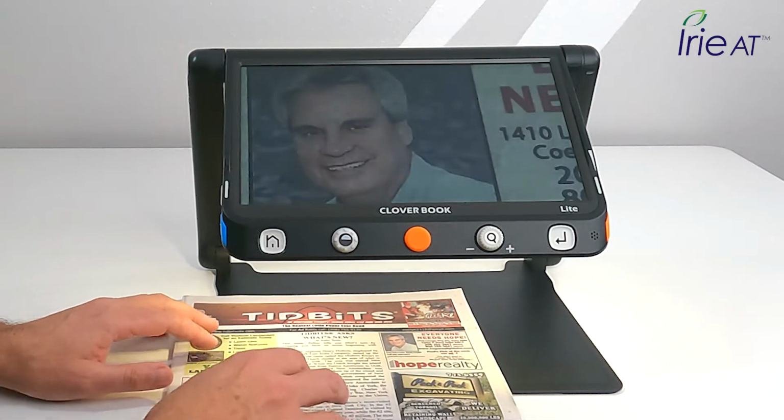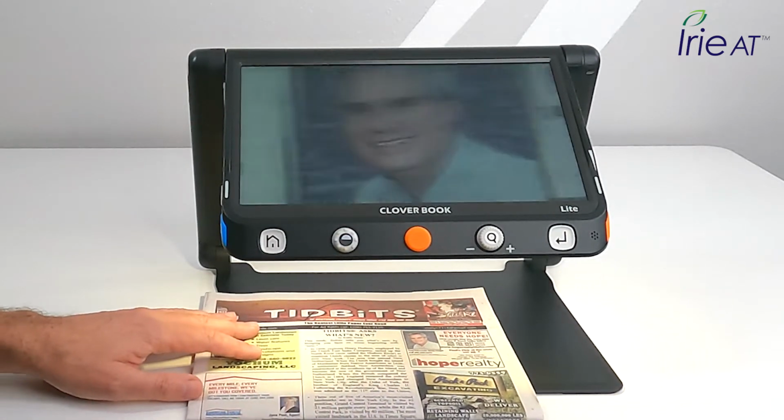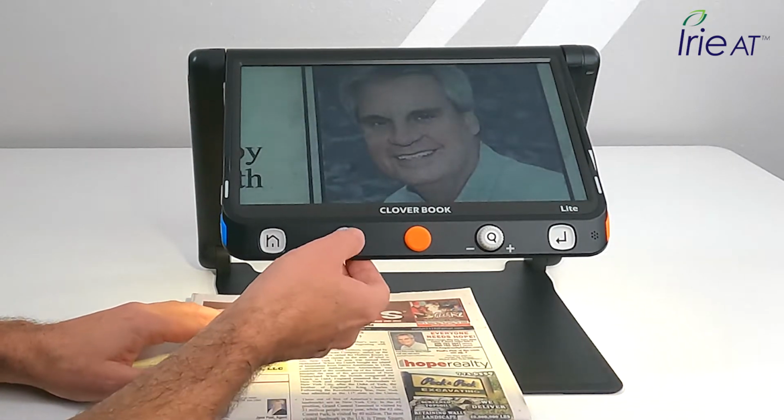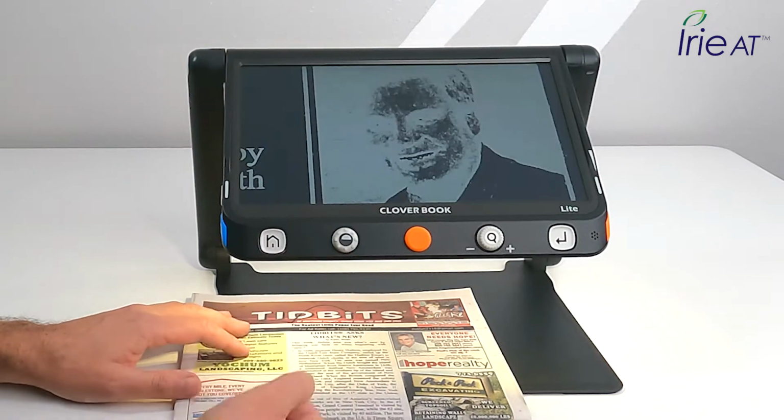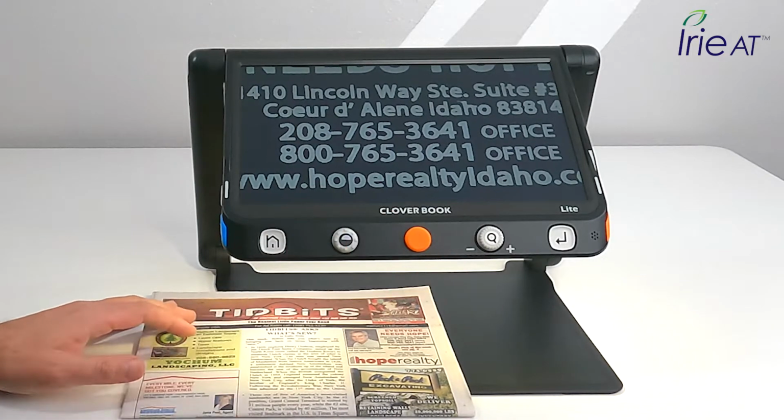There's a lovely photograph of the gentleman here. Boop, I'm reading. Boop, press the button, and I'm looking at photographs. So that's a cool feature. So really it doesn't matter if you keep all the colors or not. It's easy to switch between them.